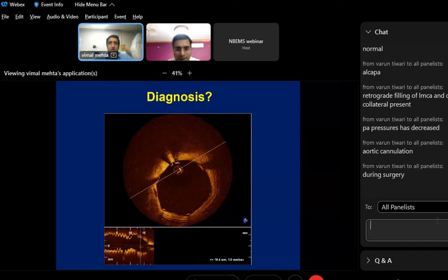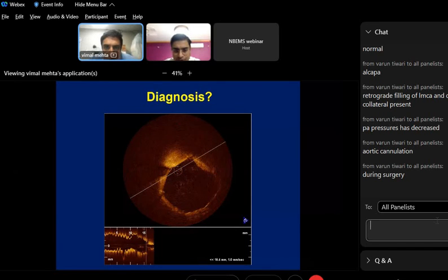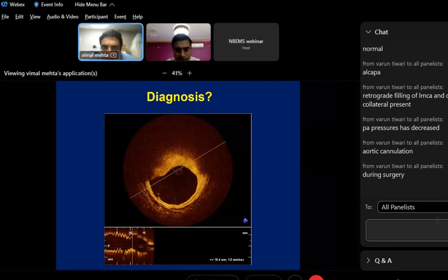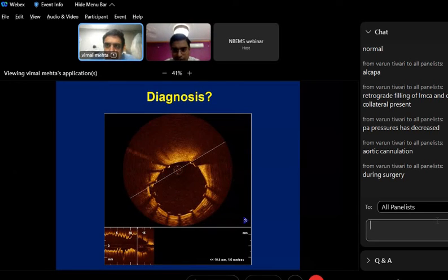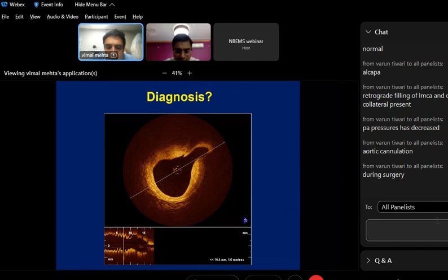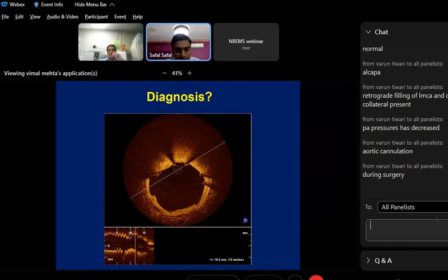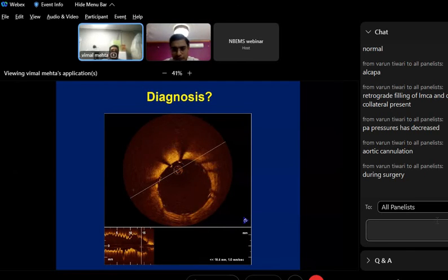What is the criteria for significant dissection? Don't want full criteria, a little bit. Somebody said don't do anything about it. See, no, there is no thrombus. There is nothing intraluminal actually. How many degrees? What length? Tell us something. So there is a criteria.